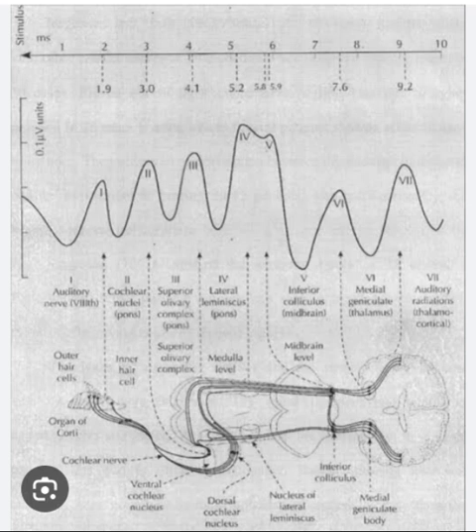Non-specificity. BERAs are influenced by various factors, and the waveforms themselves are not specific to a particular etiology. Various conditions, including peripheral hearing loss, brainstem lesions, demyelinating diseases, or systemic disorders, can lead to similar BERA abnormalities. Therefore, BERAs serve as a screening and diagnostic tool but should be interpreted in conjunction with other clinical findings and imaging studies. 22. Interpretation expertise.